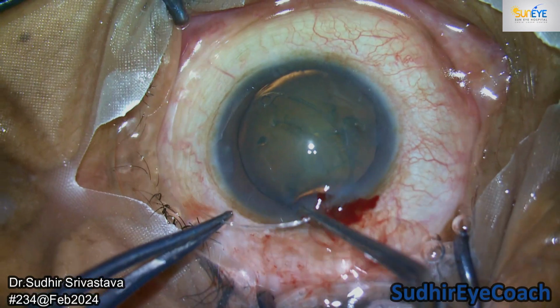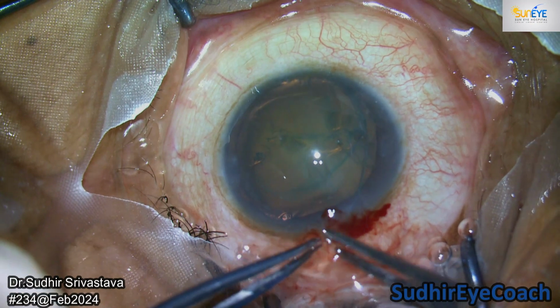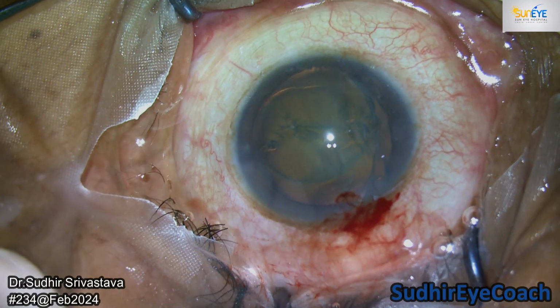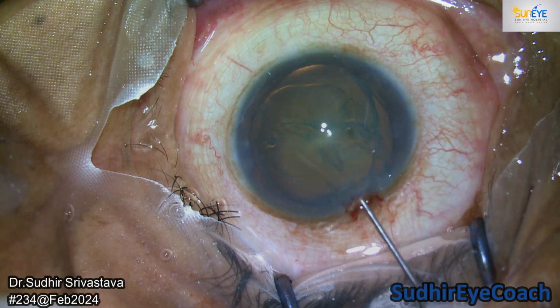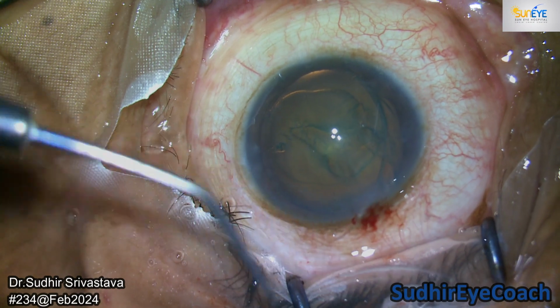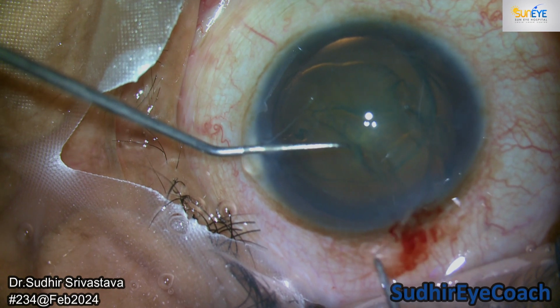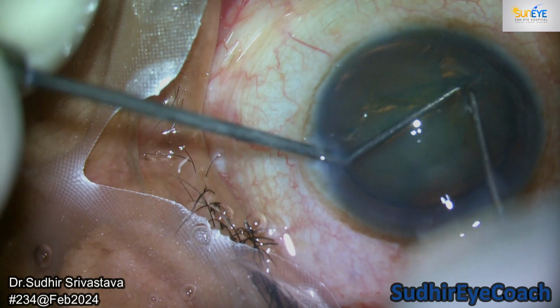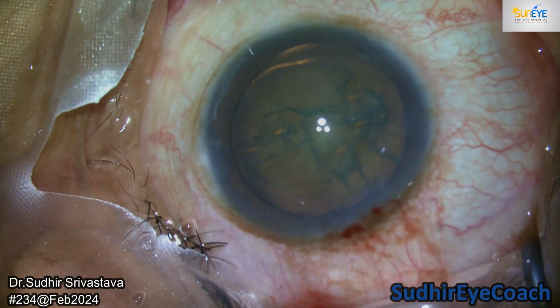Endocapsular ring is a saver in such cases. Always dilate properly, select the size of the ring properly, and you can use different techniques for the implantation. I always use two Sinskey hooks to manipulate, so always dial the leading haptic in the bag before doing the hydro procedures, because the visibility is always good. Then hold the ring with one Sinskey, and then you can release it with the help of the second Sinskey.